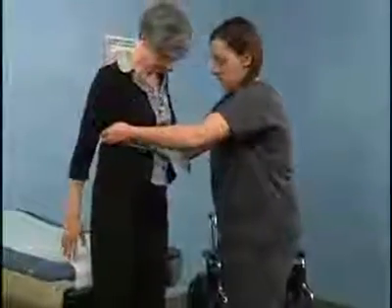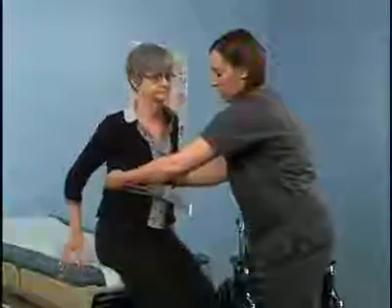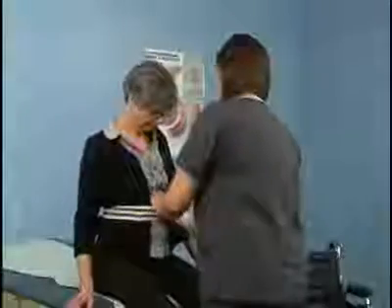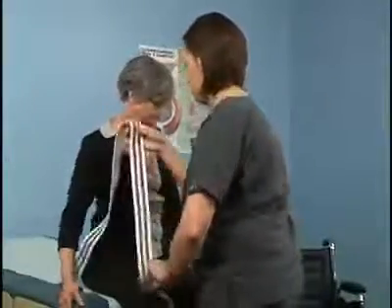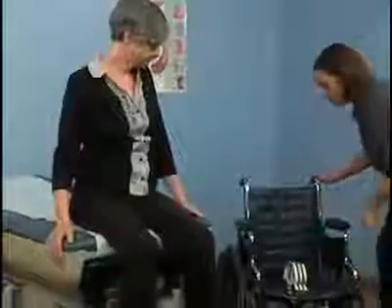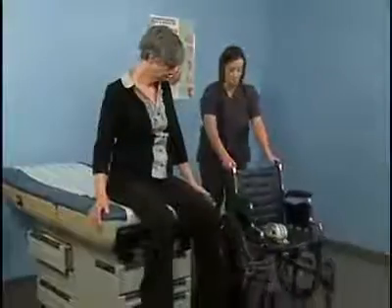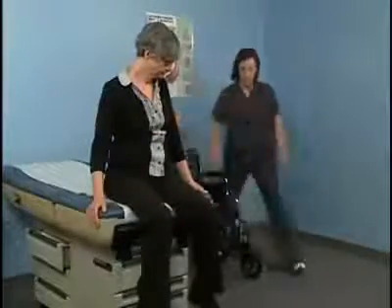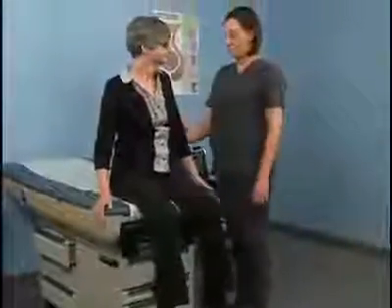Gradually lower the patient into a sitting position so that the buttocks and thighs are firmly supported on the table. Remove the transfer belt. Unlock the wheelchair and move it out of the way. Push in the footrest of the examining table. Stay with the patient to prevent falls.